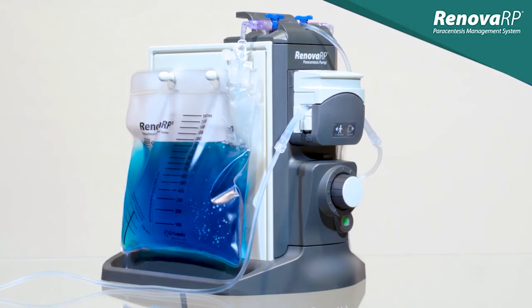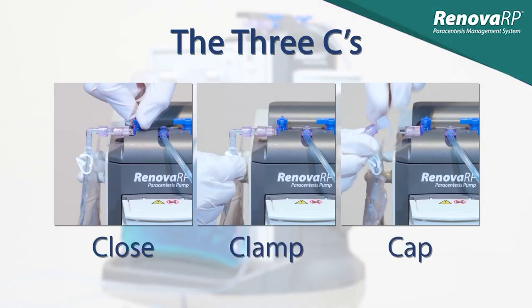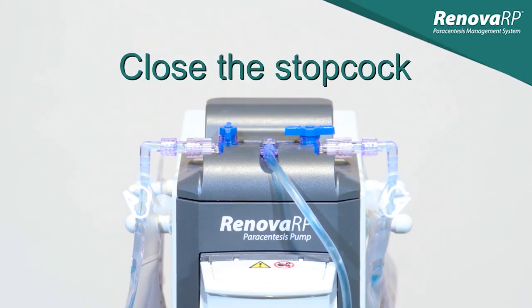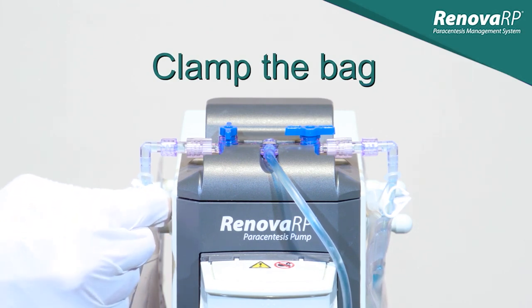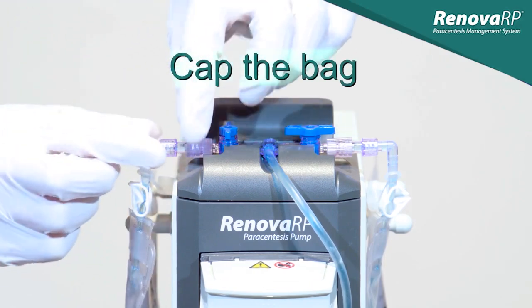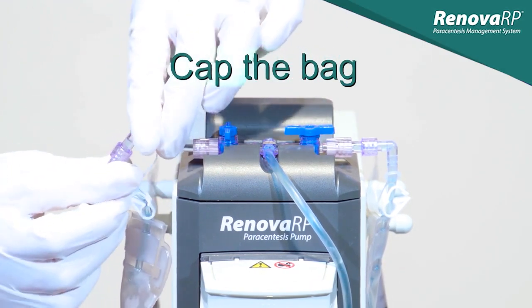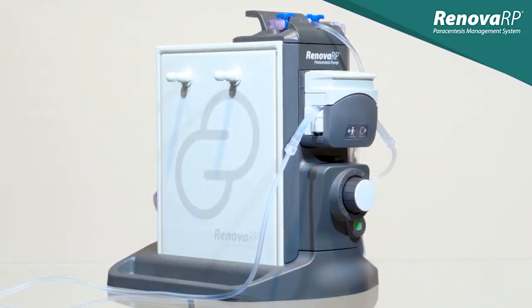When the first bag becomes full, remember the three C's: Close, Clamp, Cap. Close the stopcock first to cease fluid flow to the bag. Next, clamp the bag shut using the white pinch clamp. Loosen the spin-lock connector and remove the bag from the T-connector. Once the bag is removed, cap it and follow your facility's procedural protocol for handling ascitic fluid.